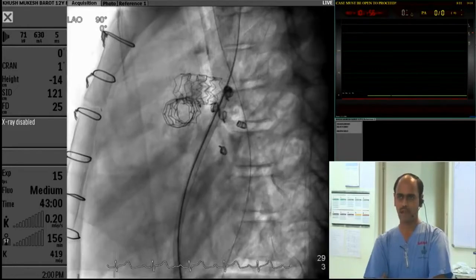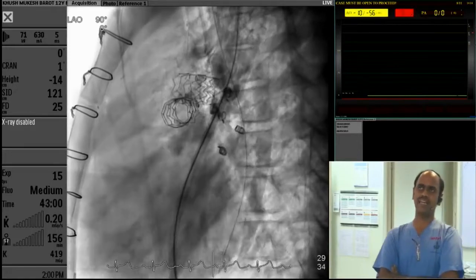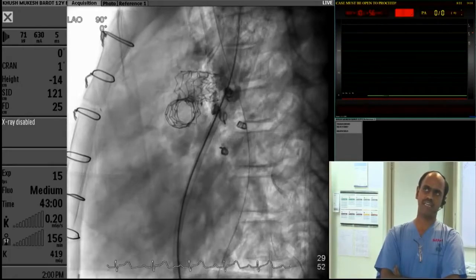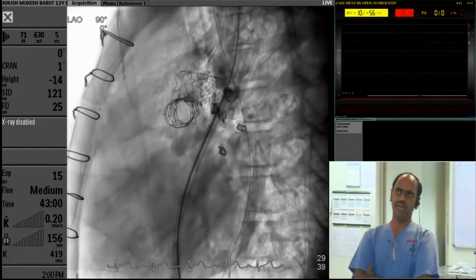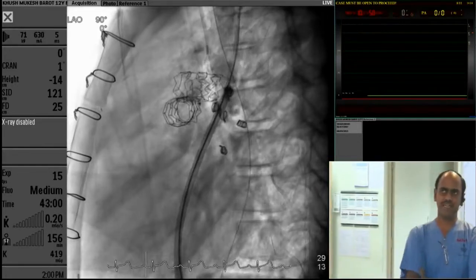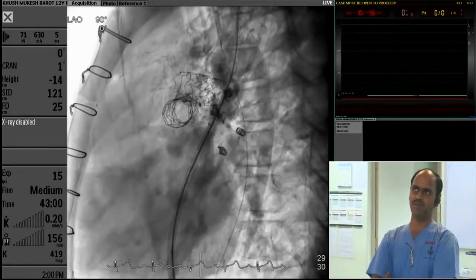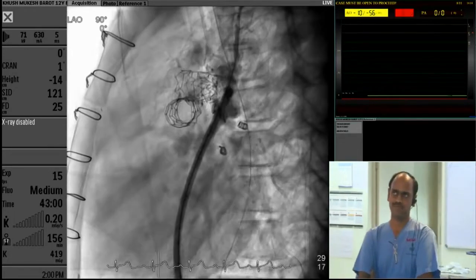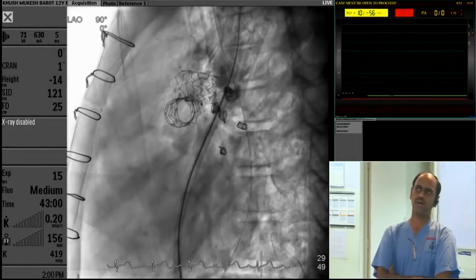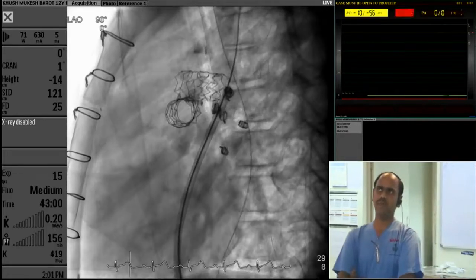We can see air in the anterior part — there are quite a few bubbles. There is air floating in the ascending aorta, going up and down with each pulsation of the aorta. One of my colleagues noticed a transient ST elevation during this time. However, the hemodynamics remained reasonably stable. That is one blunder. There are also some more bubbles in the area of the stent in the background.